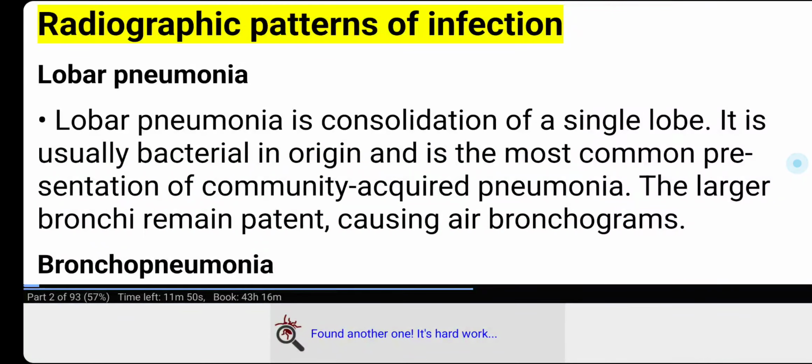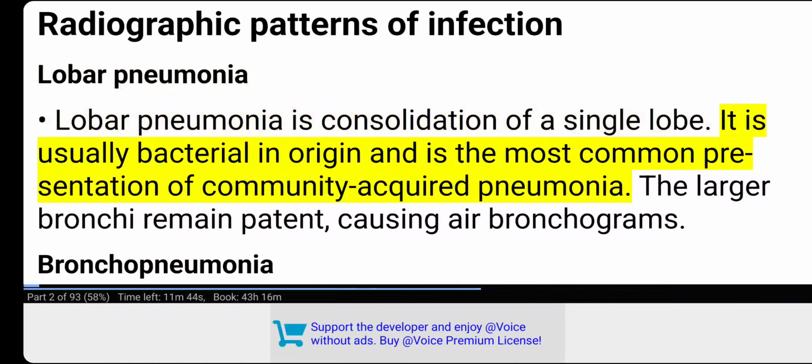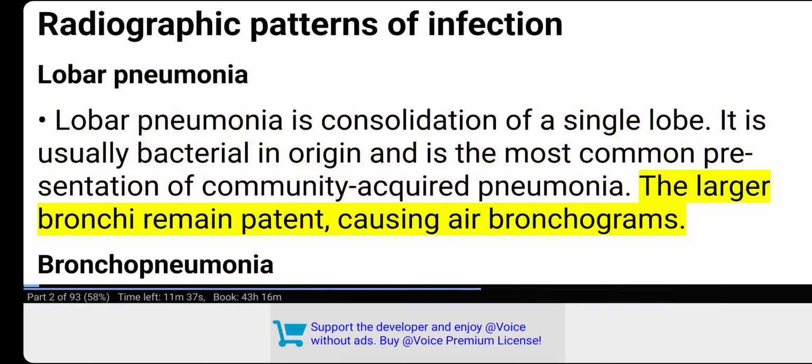Radiographic patterns of infection. Lobar pneumonia. Lobar pneumonia is consolidation of a single lobe. It is usually bacterial in origin and is the most common presentation of community-acquired pneumonia. The larger bronchi remain patent, causing air bronchograms.